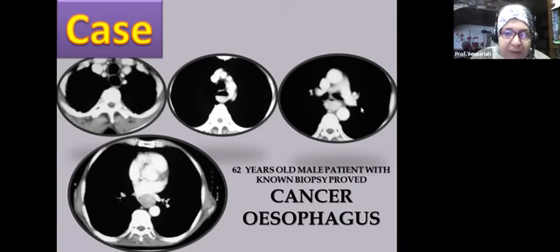Okay, and as you can see here, the dilatation of the esophagus, as used in classic teaching of surgery, is that the dilatation in case of cancer is not as marked as in achalasia.